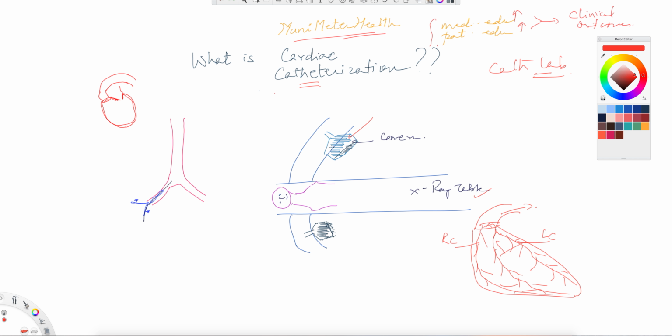And then you have a camera which is now not only giving you visualization under X-rays, you can actually take pictures as well. It sometimes has dual cameras. There are triple cameras depending upon the kind of cath lab you're talking about. And basically, there's a beam which tends to go in this fashion, comes down like that. So you could be slid up like that on the X-ray table, or slid down, depending upon what positions the cardiologist desires you to have. Or sometimes you could even be rotated on one side as opposed to the other.